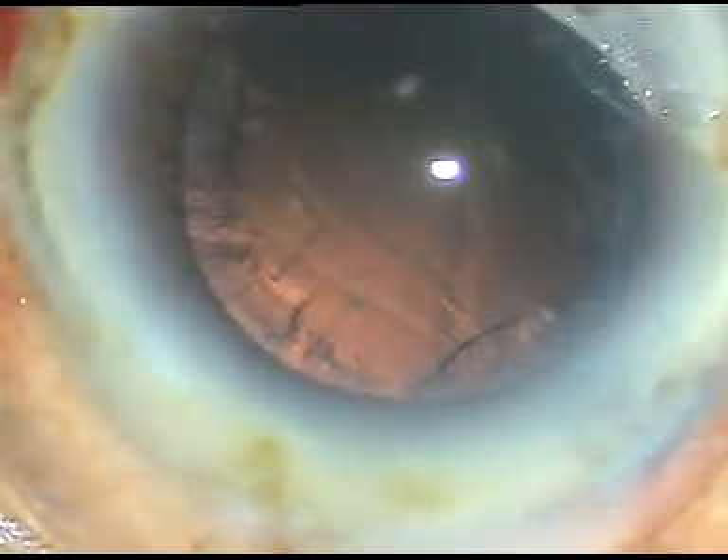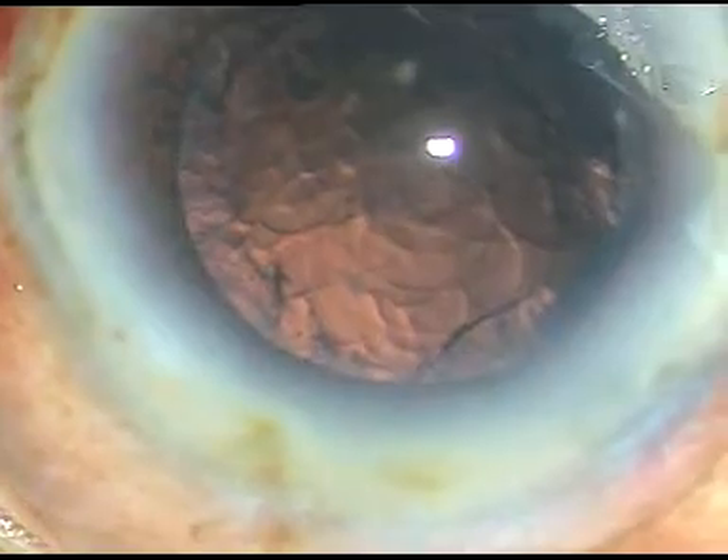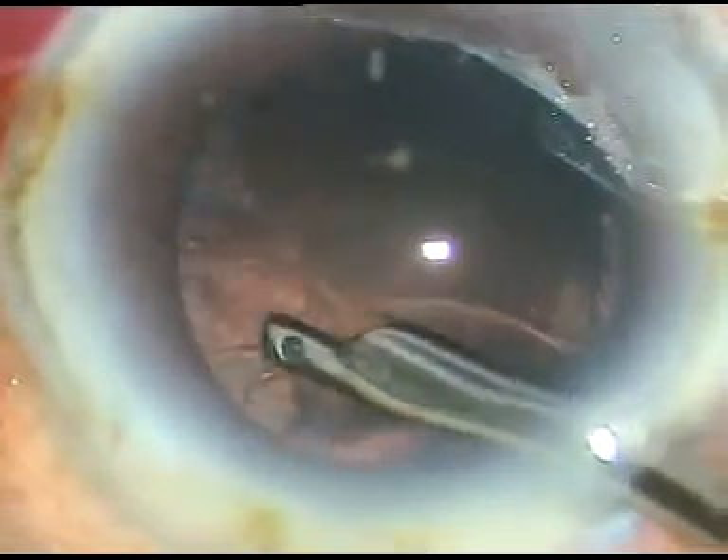Now viscoelastic substance is injected. We can see some red glow. Viscoelastic substance is injected and this little bit of cortical matter — there is no epinucleus, as it has been incorporated into the nucleus.